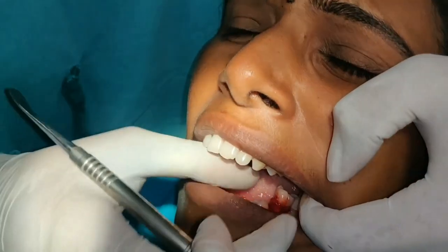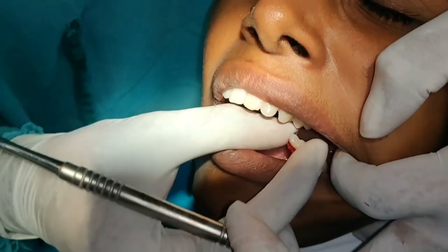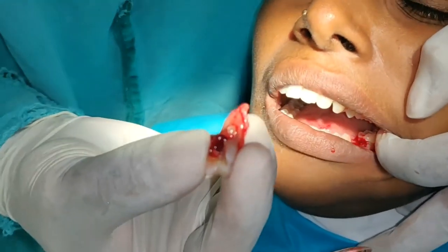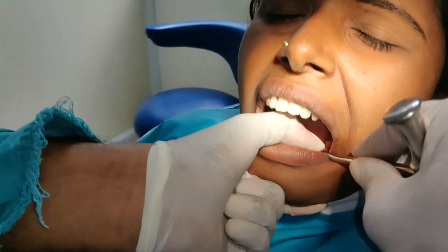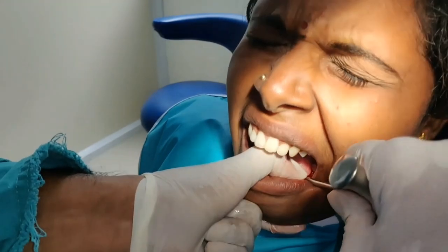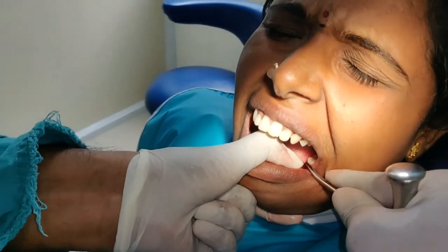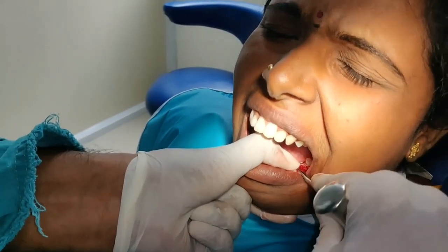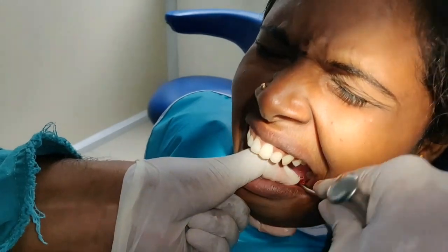As I am applying the technique, the tooth comes out, but unfortunately only one root comes out. The other root is still intact in the socket. So I am employing a wheel and axle principle by using the help of a crossbar.